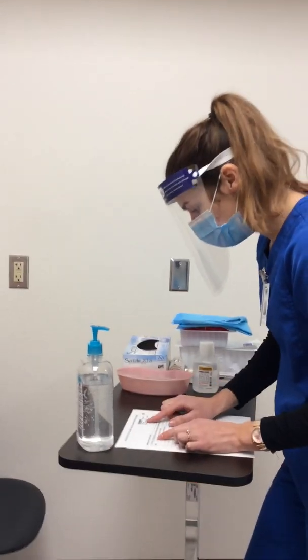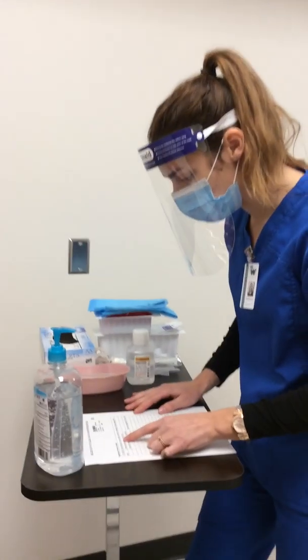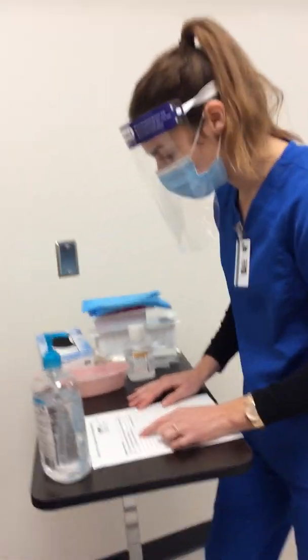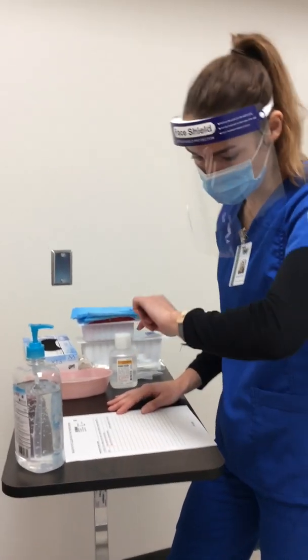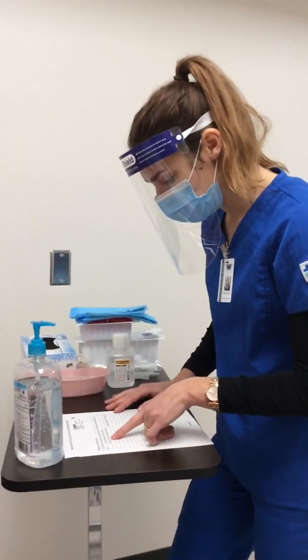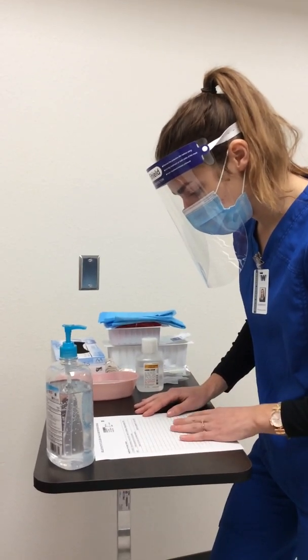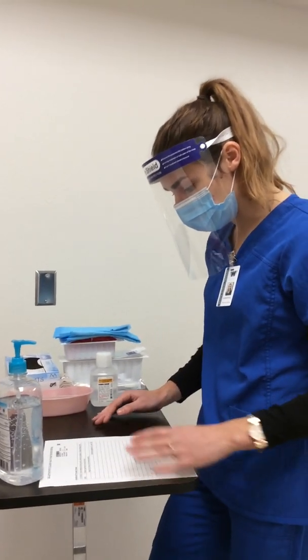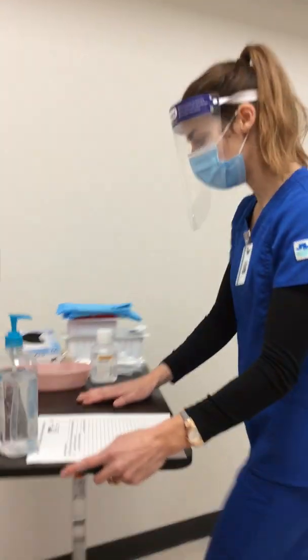She is Shirley Coast, 4/3/1987. She needs a daily dressing of the wound with a wet to dry dressing, and we're changing that as needed. At 9 o'clock, we will obtain a wound culture, and it's getting close to that time, so we'll grab our supplies and head in there. And then we'll also be applying an ACE wrap on the left lower extremity. So I'm going to gather my supplies and then head into her room.